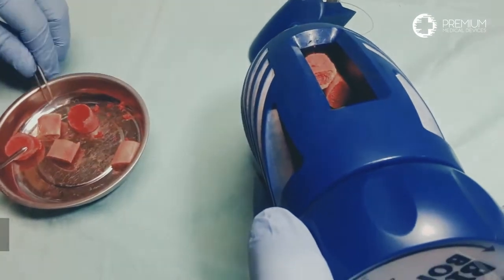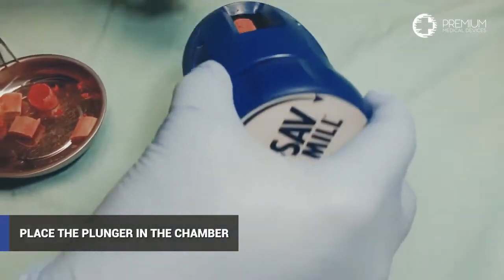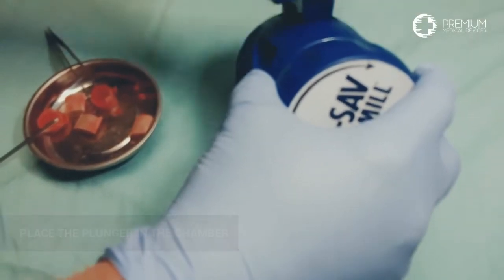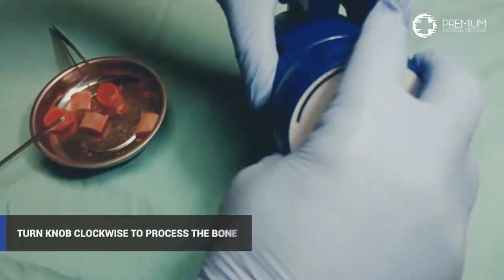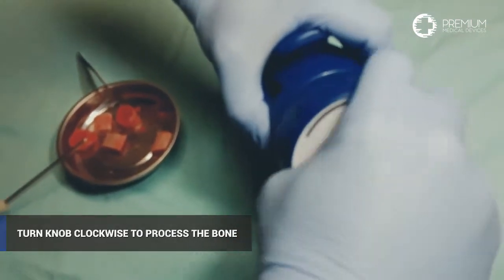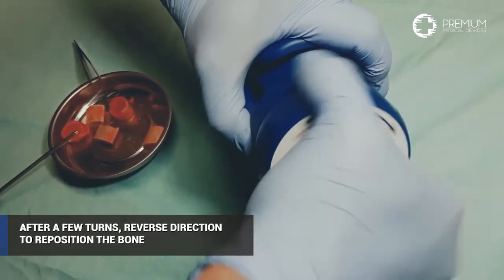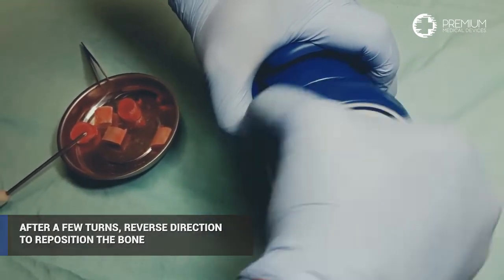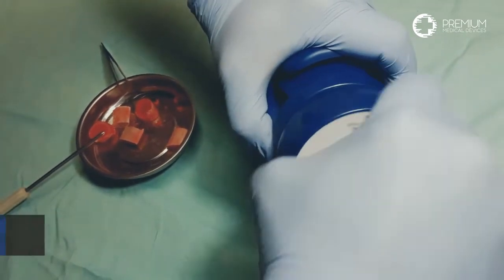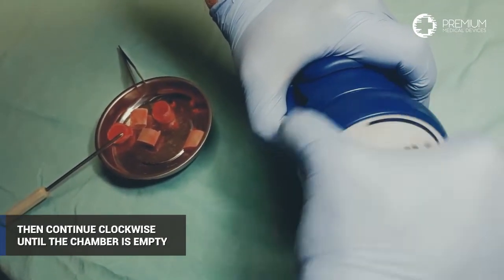Once a desired amount of bone is in the chamber, place the plunger in the chamber and lightly depress until you feel cutter engagement. It is a feel that you will develop for the amount of pressure to place on the plunger, but the rule of thumb is a light press with increasing force until cutter-bone engagement. You will feel the bone being reduced as the plunger incrementally drops lower into the chamber.